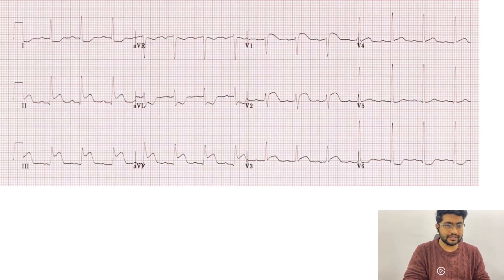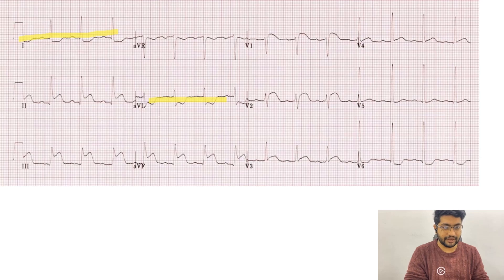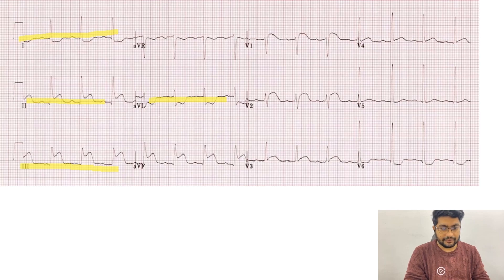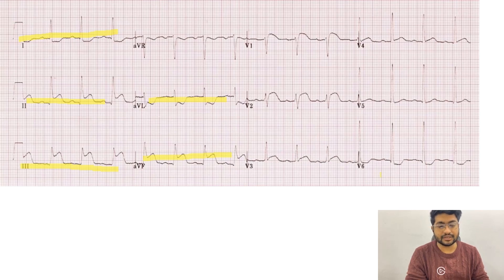Here is another ECG: in lead 1 we have ST segment depression, in lead AVL we have ST segment depression, and we have elevation in lead 2, lead 3, and lead AVF. Then we have a small elevation in lead V1 and lead V2; the rest of the ECG is normal.